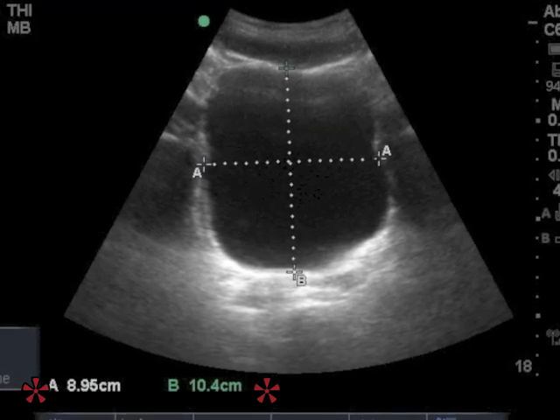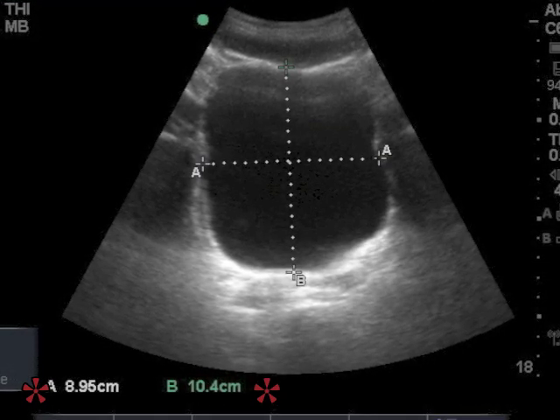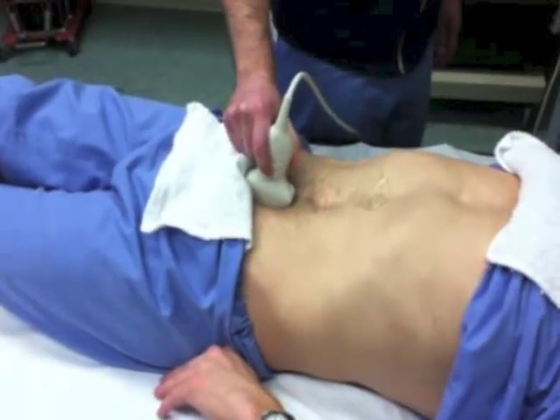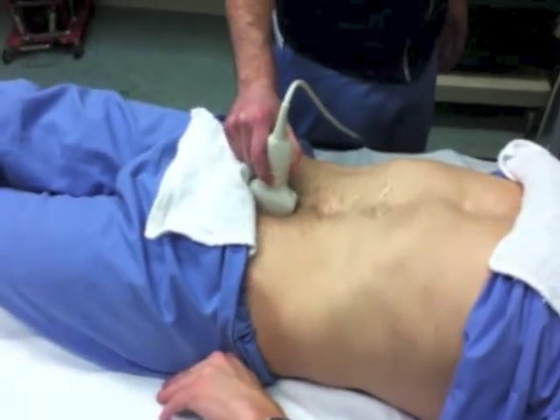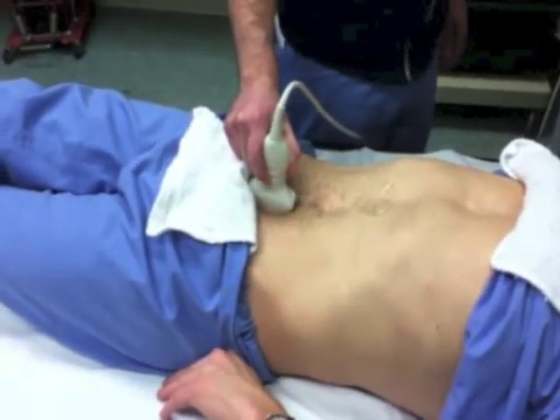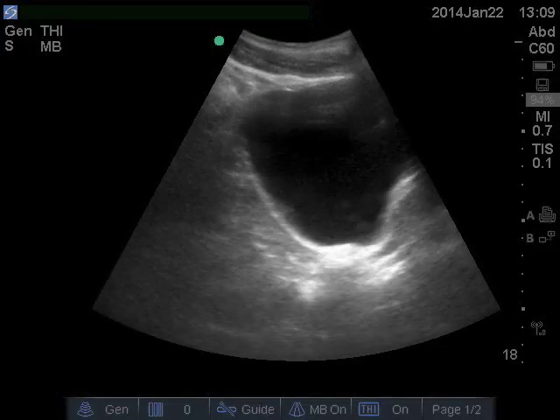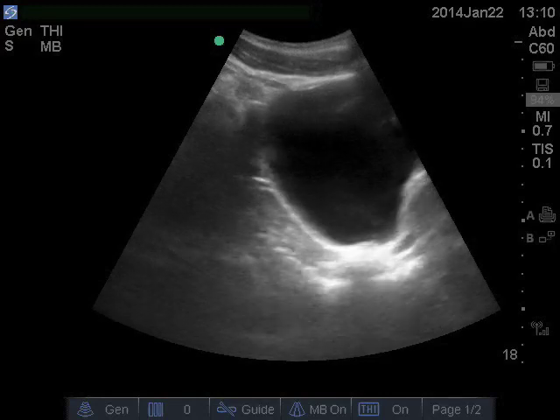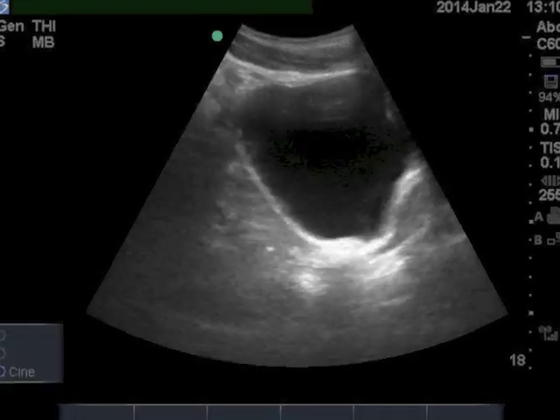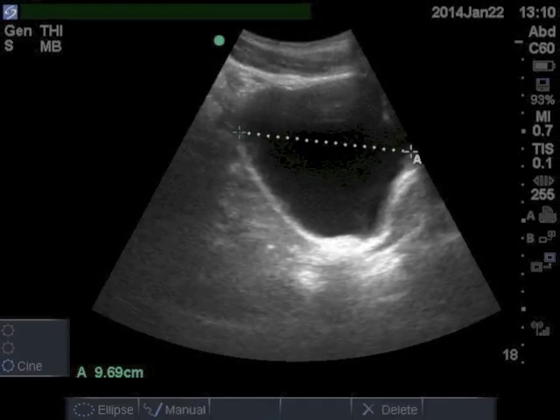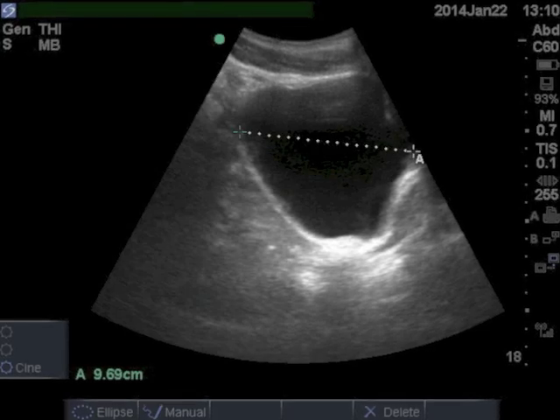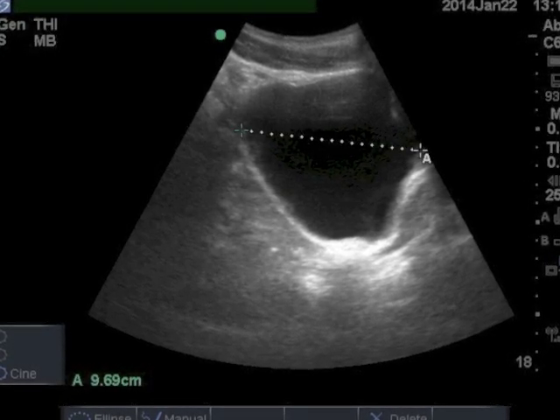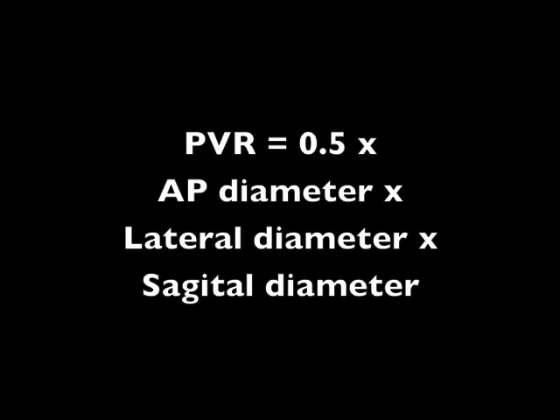Now push the freeze button again to unfreeze the image. Rotate the probe to the sagittal up-down plane and again tilt it down into the pelvis and rock it left and right until you find the maximum dimension. Freeze the image and use the caliper and select buttons to measure the maximum sagittal distance. Write this down.